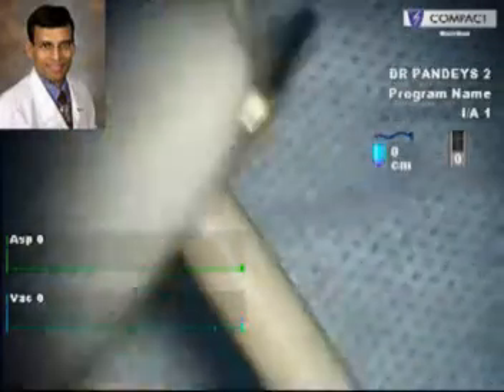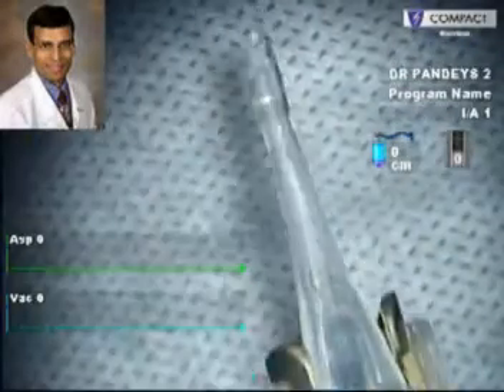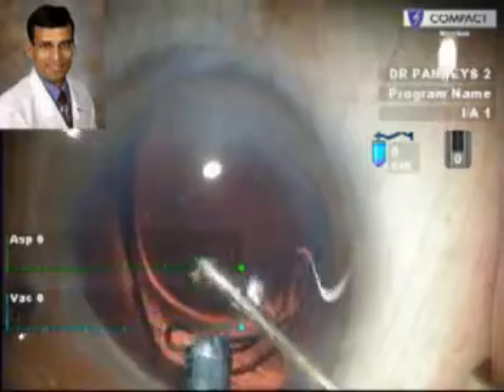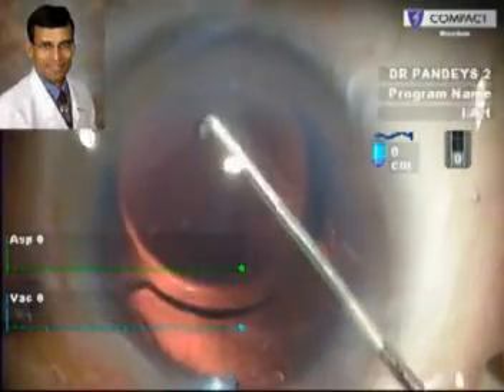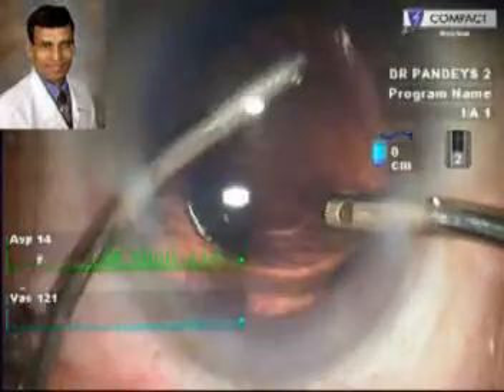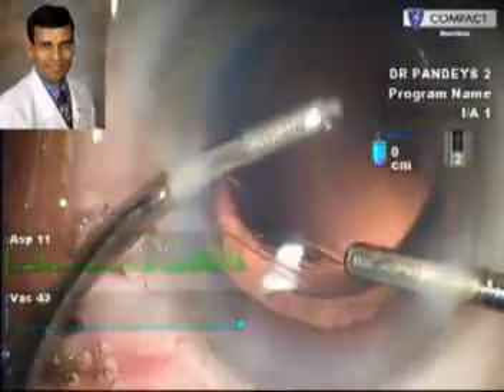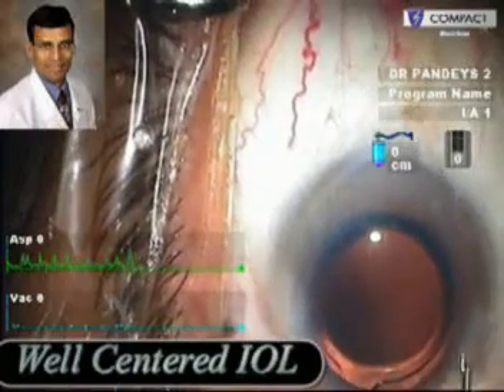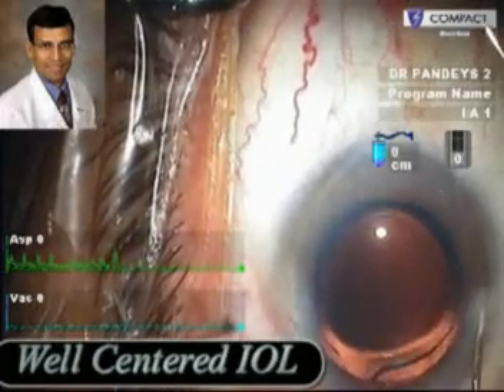This is the IOL being put into the cartridge and then it can be implanted into the bag using the AMO injector. Single-piece IOLs are much easier to implant and this IOL has great advantages compared to the older 3-piece SENSAR IOL, because it avoids any possibility of kinking or damage to the haptics during implantation — either while loading into the cartridge or during implantation with the injector. The IOL goes very smoothly into the capsular bag with very good centration, without any tilting or decentering at all.